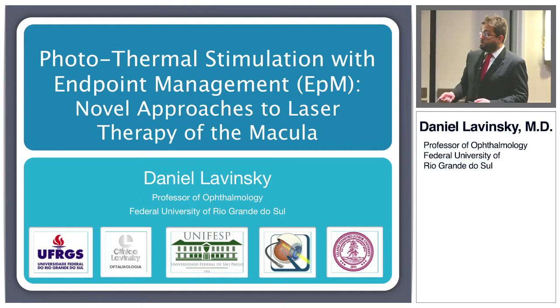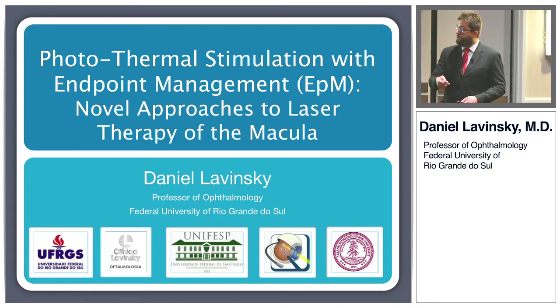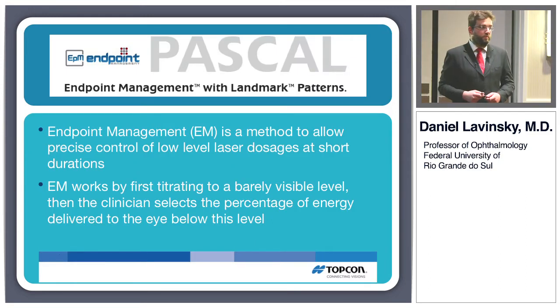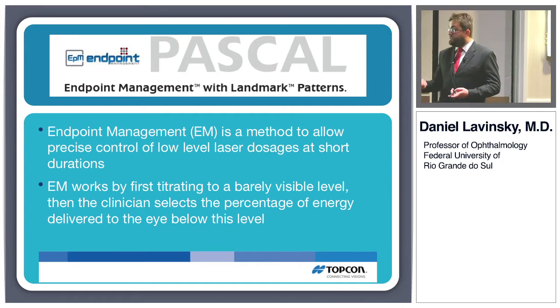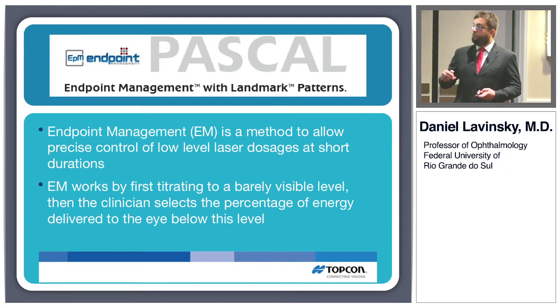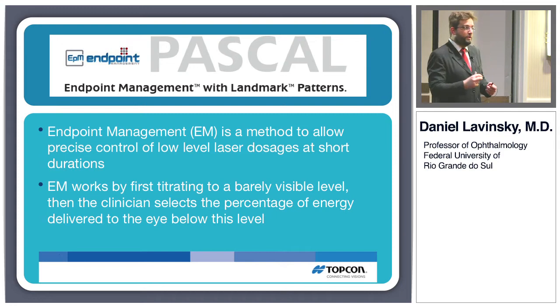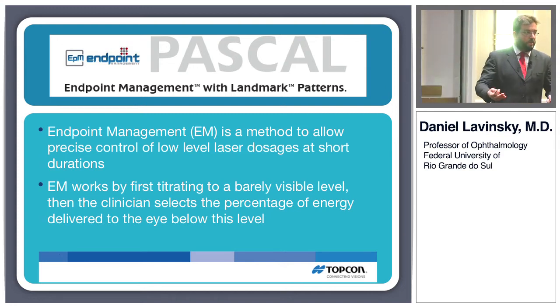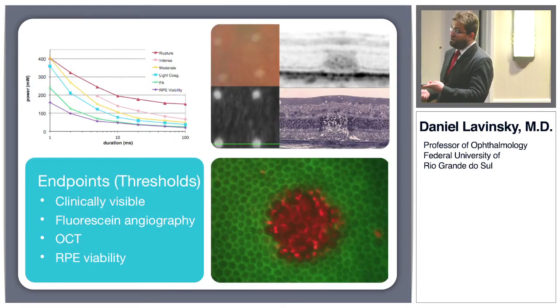So we are going to talk a little bit about novel approaches clinically with this kind of strategy. Endpoint management, Daniel already talked about the basic science behind it. It's a method to allow precise control of levels of dosage of short durations. The thing that really defines endpoint management is the decision of what endpoint you want. The endpoint could also be the threshold.